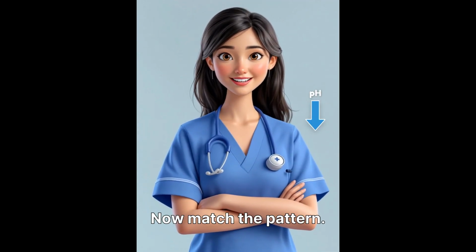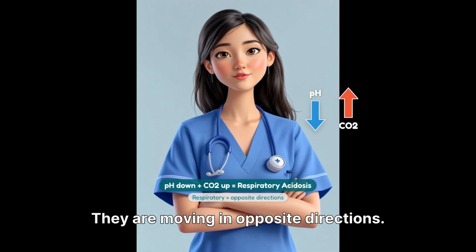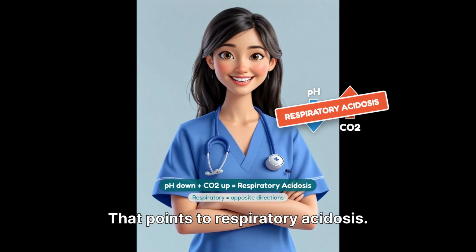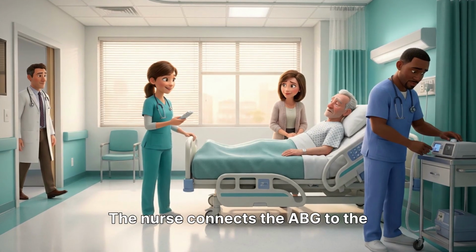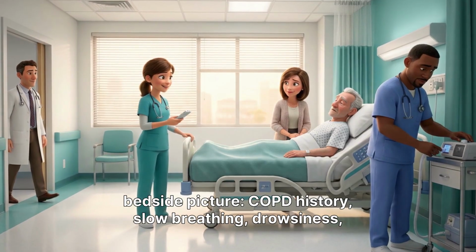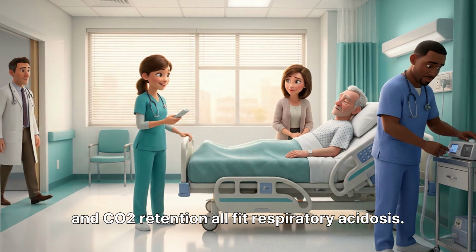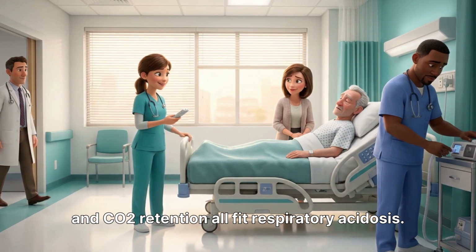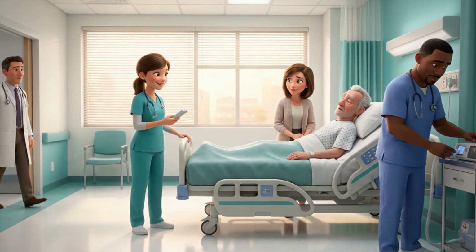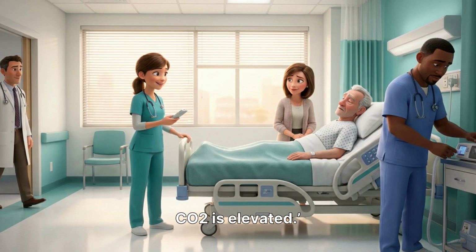Now match the pattern. The pH is low and CO2 is high. They are moving in opposite directions. That points to respiratory acidosis. The nurse connects the ABG to the bedside picture. COPD history, slow breathing, drowsiness, and CO2 retention all fit respiratory acidosis. Nurse: His ABG matches what we're seeing. He's breathing slowly, he's drowsy, and his CO2 is elevated.